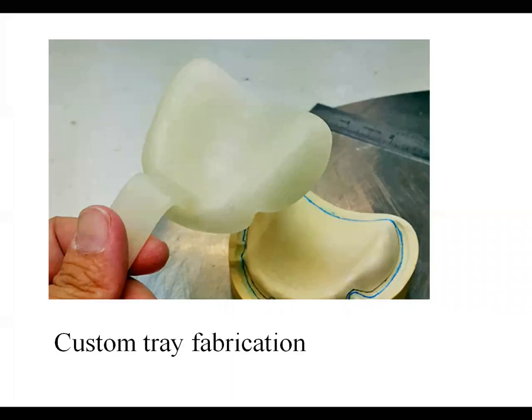It represents the position of your central incisor. And whenever you insert the custom tray in the patient's mouth, you will come to know how the aesthetics of the patient are. For that purpose, we prepare a handle at 45-degree angulation.